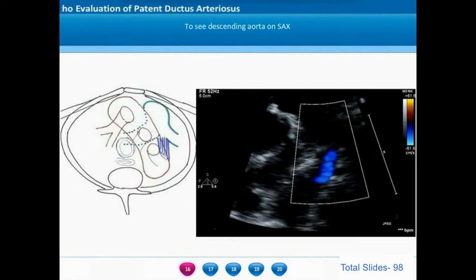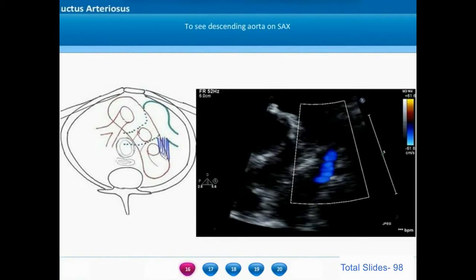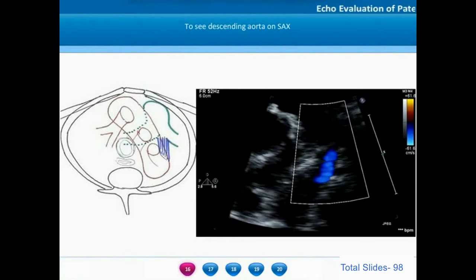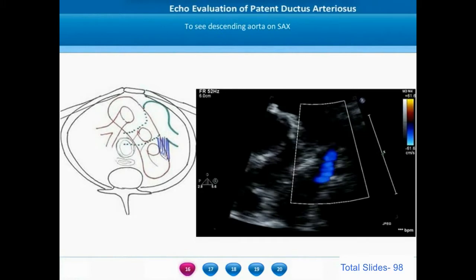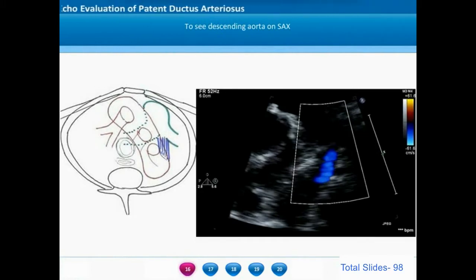The ductus connects the pulmonary artery bifurcation to the descending thoracic aorta. Since this PDA is a very hypertensive PDA with pulmonary artery pressures higher than aortic pressures, we are able to see continuous flow from the pulmonary artery into the descending aorta.